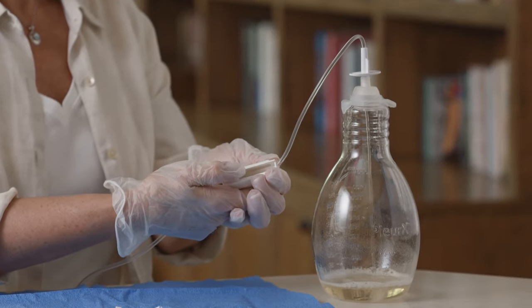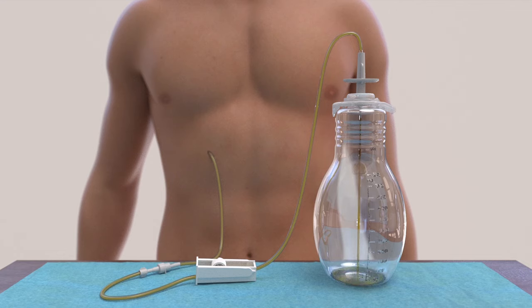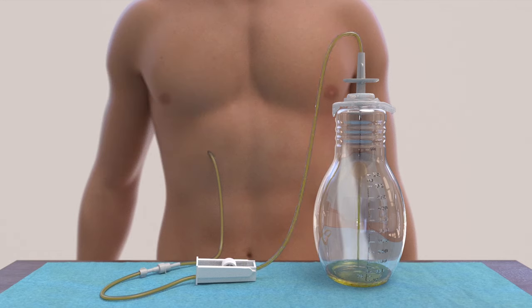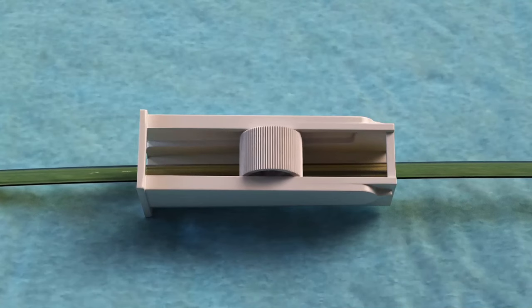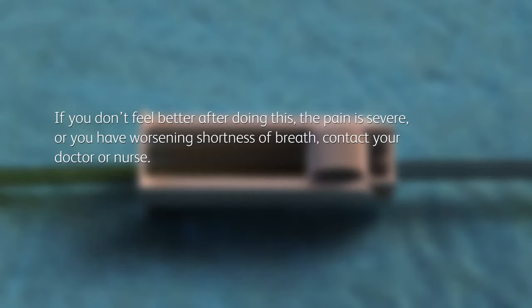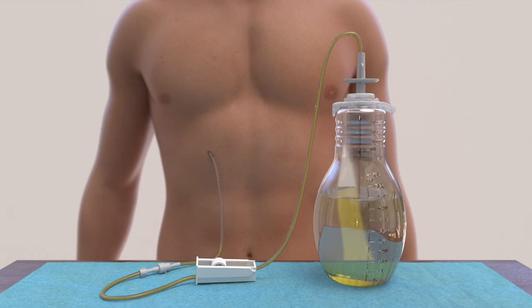Fluid will start to flow into the vacuum bottle. You can adjust the flow by moving the wheel on the roller clamp as desired to open or close the clamp. Drainage usually only takes 5 to 15 minutes. It's normal to feel some discomfort or pain when draining fluid. If you experience discomfort or pain, roll the wheel on the roller clamp toward the bottle to slow or stop the flow of fluid for a few minutes. If you don't feel better, or the pain is severe, or you have worsening shortness of breath, contact your doctor or nurse. Although rare, pain may be an indication of infection. The flow into the bottle may slow down when the fluid is almost completely drained, and it's normal to feel some discomfort as the rate of flow decreases or stops — this is a sign that you have completed your drainage.